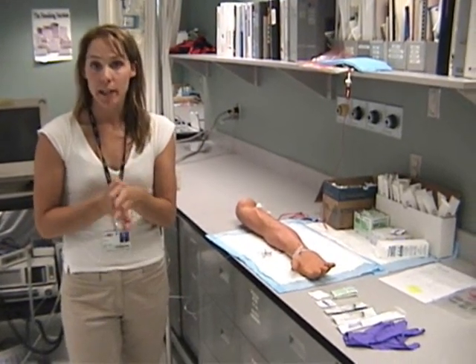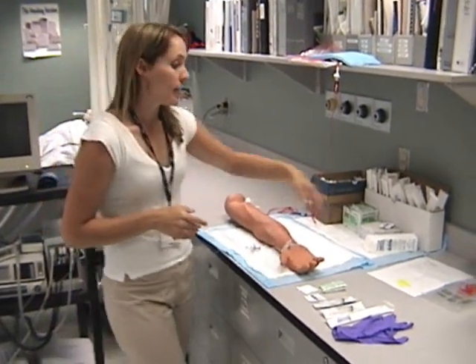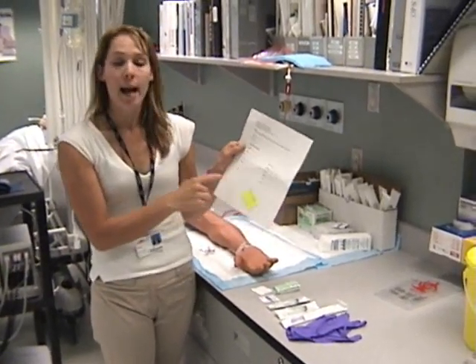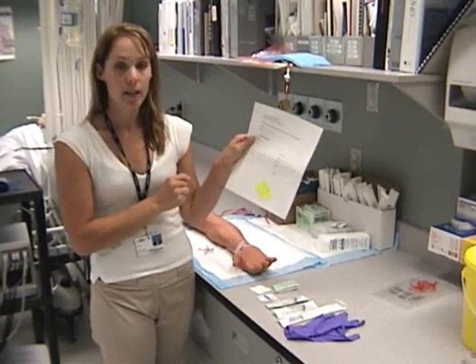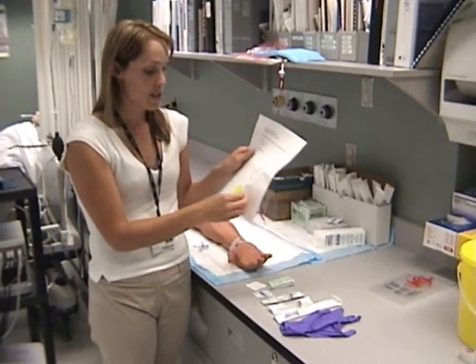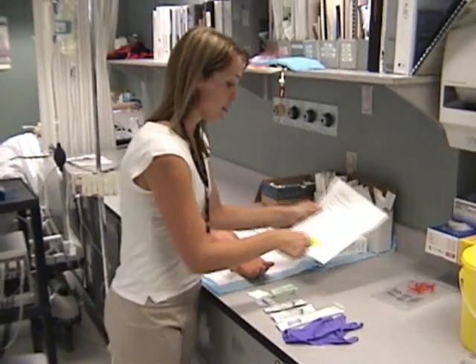First, you need to check your physician's order. Get your requisition for the order and fill out the ventilator settings or the patient's FiO2. You also need your patient's label, usually a little white sticker in the hospital.